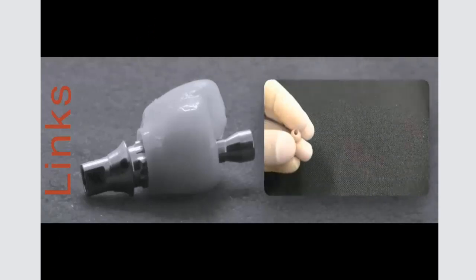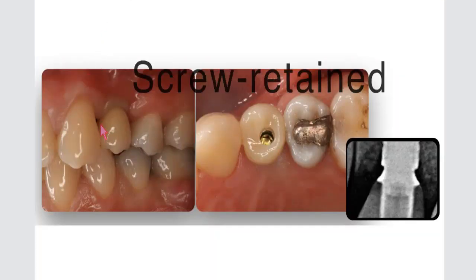Finishing the cementation, when the cementation is obtained, you're going to go and place it in the patient's mouth and you take an x-ray to check. A lot of people have asked me, Nelson, wouldn't you try in first? Of course I do. You place the abutment link and you try in if the crown is on the right position. But the cementation, I perform outside. Because if I have done everything correct, if my scan flag is on the right position, there is no reason for me to cement this restoration intraorally.